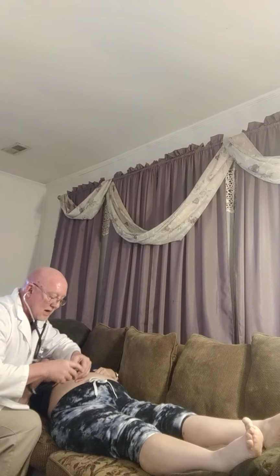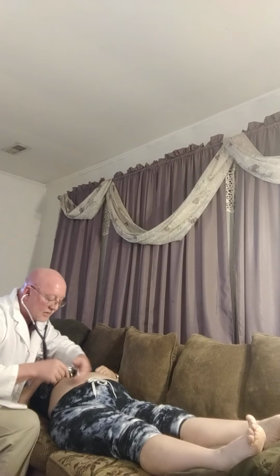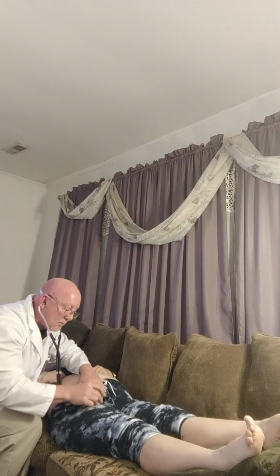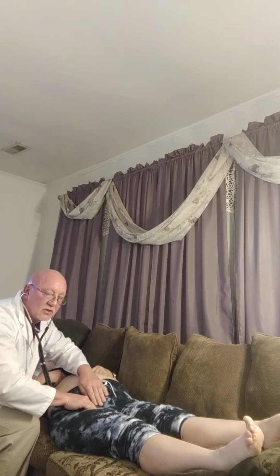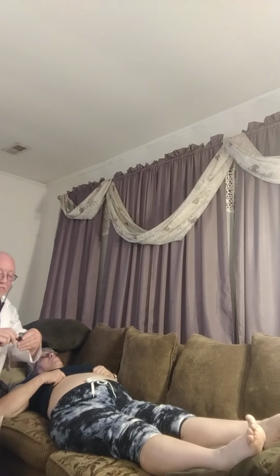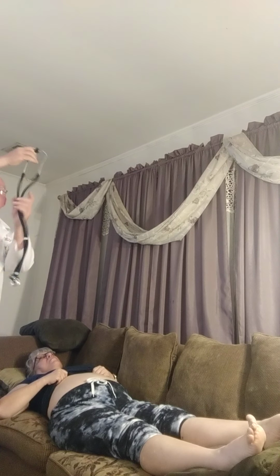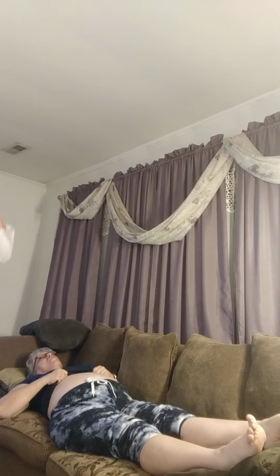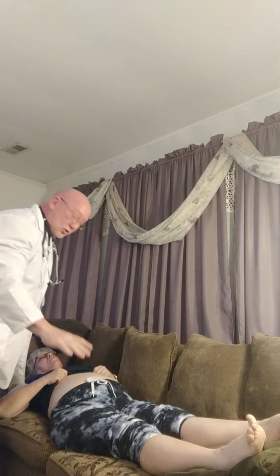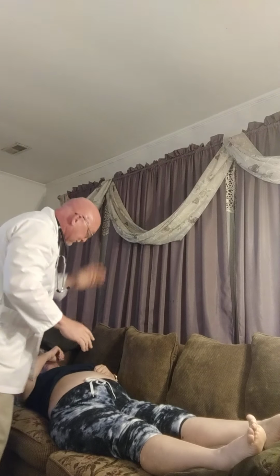We'll flip it back around. There it is. Flip that back around. Use the bell. We'll do that on both sides. Now, when we're auscultating that stuff, we didn't hear any bruit or anything, nothing abnormal.